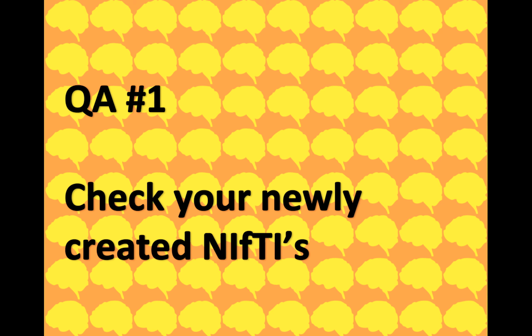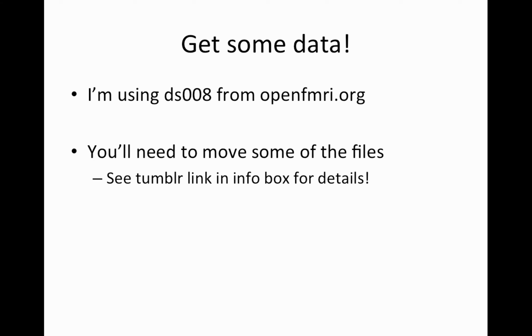If it doesn't, I would start by asking around your lab to see what people typically use, because it can change from lab to lab, and even as settings on the scanner change, you might have to do something different. So what do you do now that you have NIfTI files?